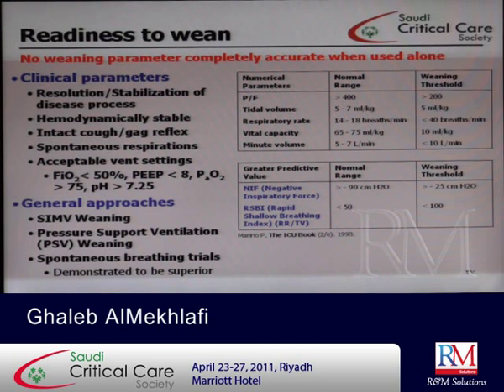What are the weaning processes? We are using these 2 modes for weaning: either SIMV, pressure support, or a spontaneous breathing trial. The best one, which shows the shortest duration from the time of weaning until extubation, is the spontaneous breathing trial, and the average is 2 days. If you follow the SIMV, the average duration until you reach extubation is 5 days. This is by one of the studies. In pressure support, it was 3 to 4 days.